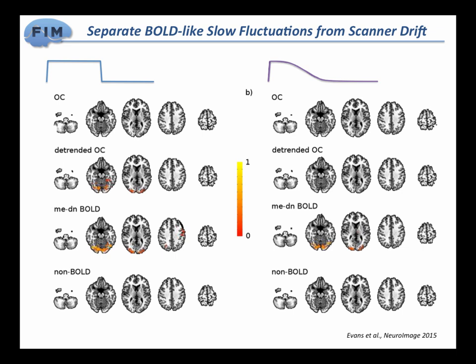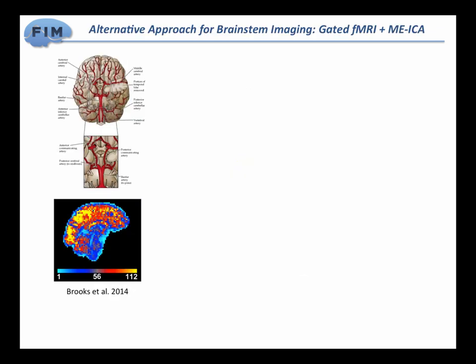When you do the detrending, you get something, especially for this one, as we saw in the time series, and you start to get some activation in visual cortex, which was the target for this task, but nothing for this other one. And it is the denoising with MEICA that actually gives you the best maps. So this is another potential application where something like MEICA makes sense.